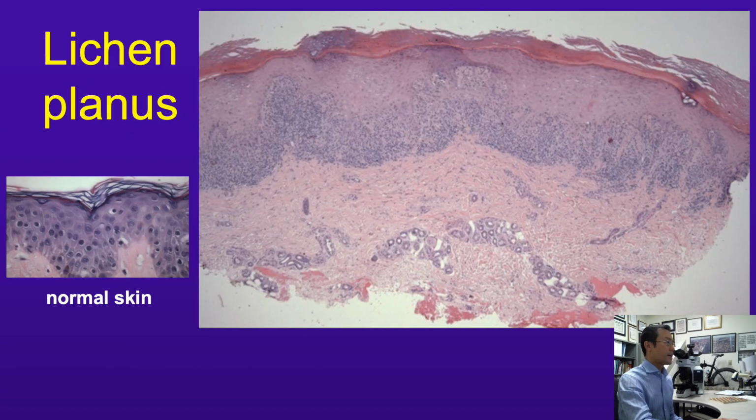Interface dermatitis can be stratified into sparse or vacuolar interface reactions and densely inflammatory or lichenoid reactions. And not surprisingly, the prototype for lichenoid interface dermatitis specifically is, again, lichen planus, as shown here. We see a number of epidermal changes that we saw before. We have a thickened, compact stratum corneum, even though the biopsy is not from the palm or sole. There are areas with hypergranulosis, often in a wedge-shaped profile, and then we have a dense band-like infiltrate obscuring the interface of the epidermis and dermis.